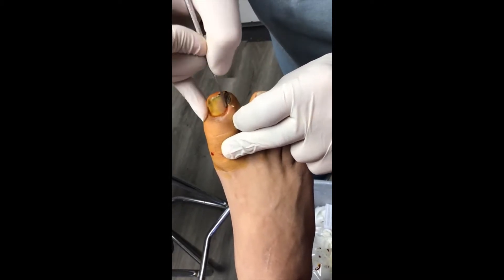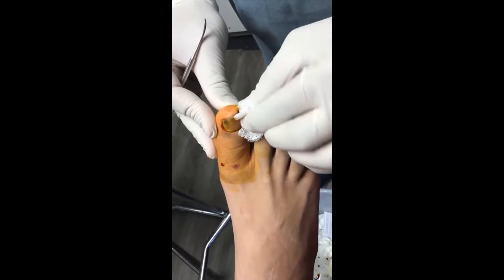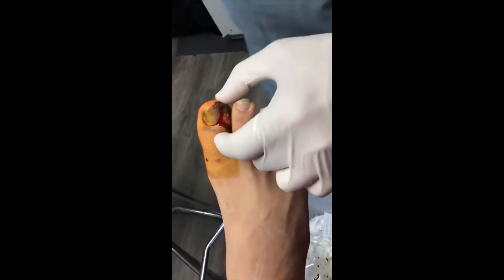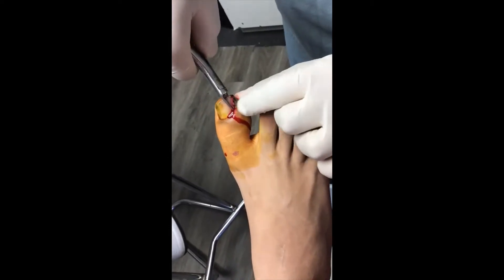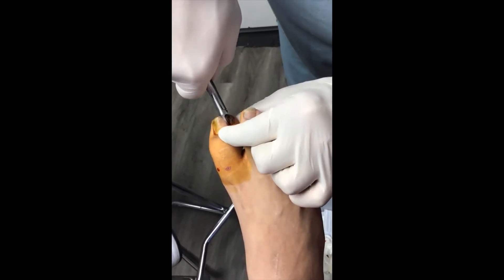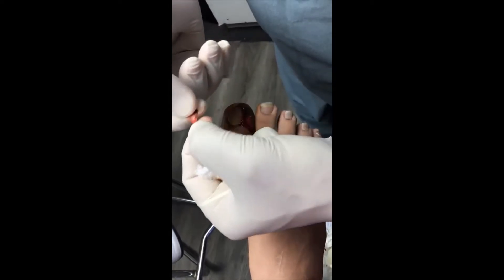No pain, right? Just concerned. When it's this bad, that means it's been there for a long time and it was infected, so we don't put a tourniquet on — we want it to bleed.